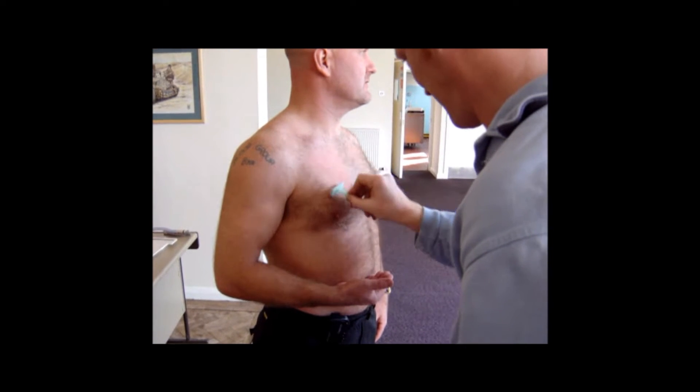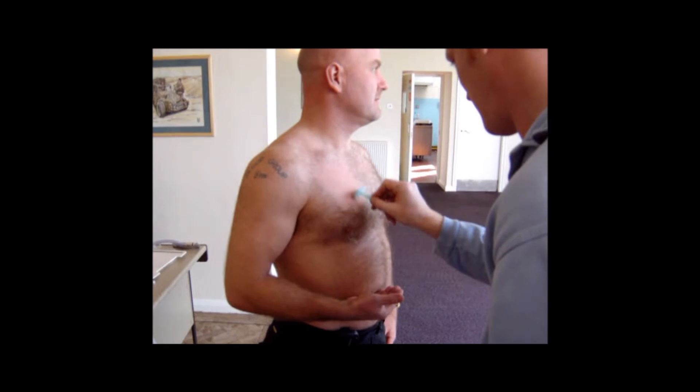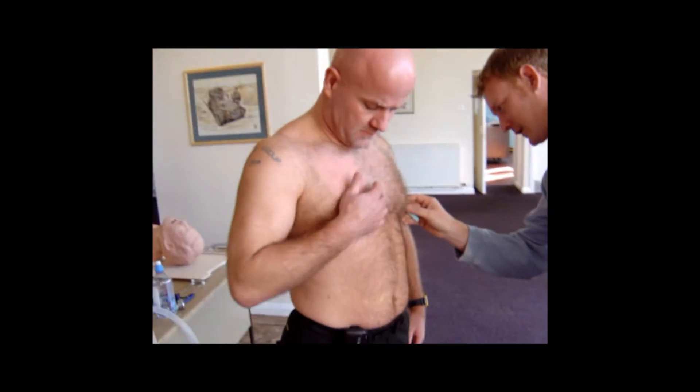Sure, if you don't get it, keep in contact. Okay, right, I have a big one. Okay, that'll do. Now do the other side. Okay, that'll do.